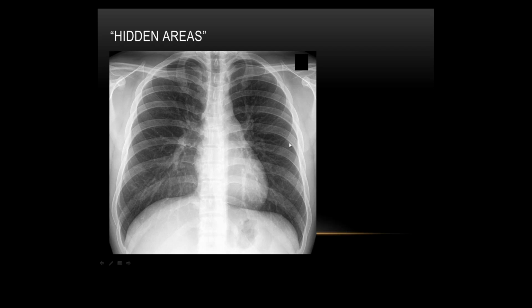So when we were presenting it as part of our training, we went through the system that we used. It was actually one of the chest radiologists who taught me the inside out method. Fortunately, it was him who was doing our advisors. So when we presented it to him, it was just the same system, so we did it that way. What I'd do is just have a look at your own system, and there's no harm in merging 2 different things together as well, and just use the system that's most comfortable to you.